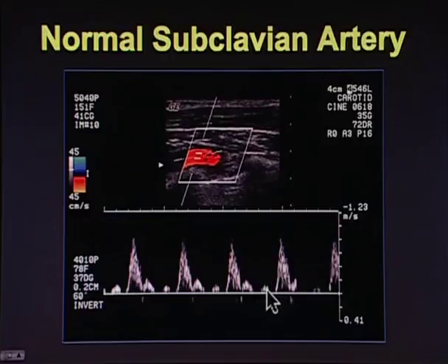We can also look at digital arteries, and again, this is an adjunct to the segmental studies. The digital arteries can be evaluated with very high-frequency transducers. We sometimes use the intraoperative transducers for looking at the digital arteries, but again, only when they're positive by segmental studies for the small digital arteries.